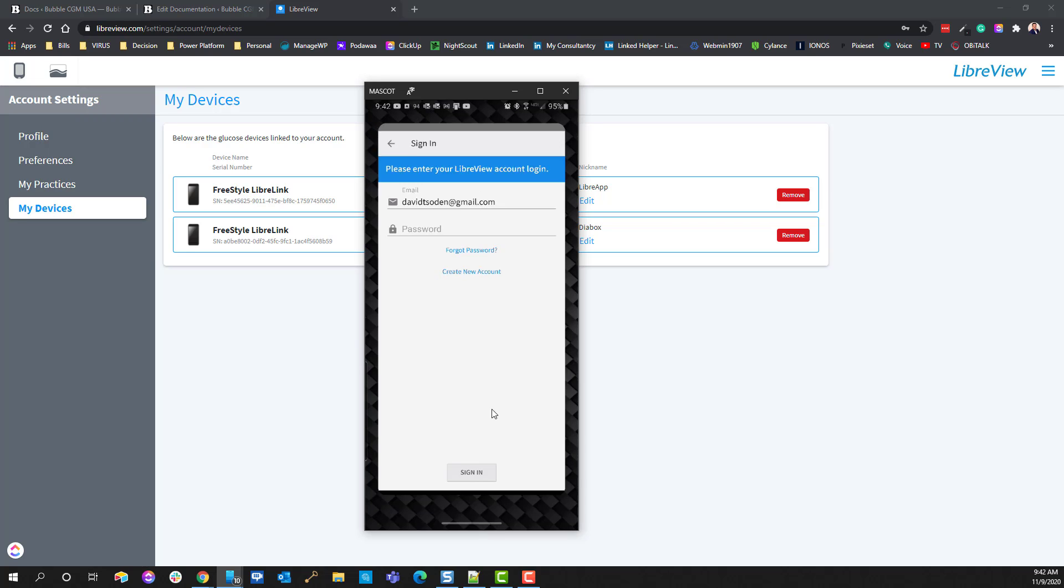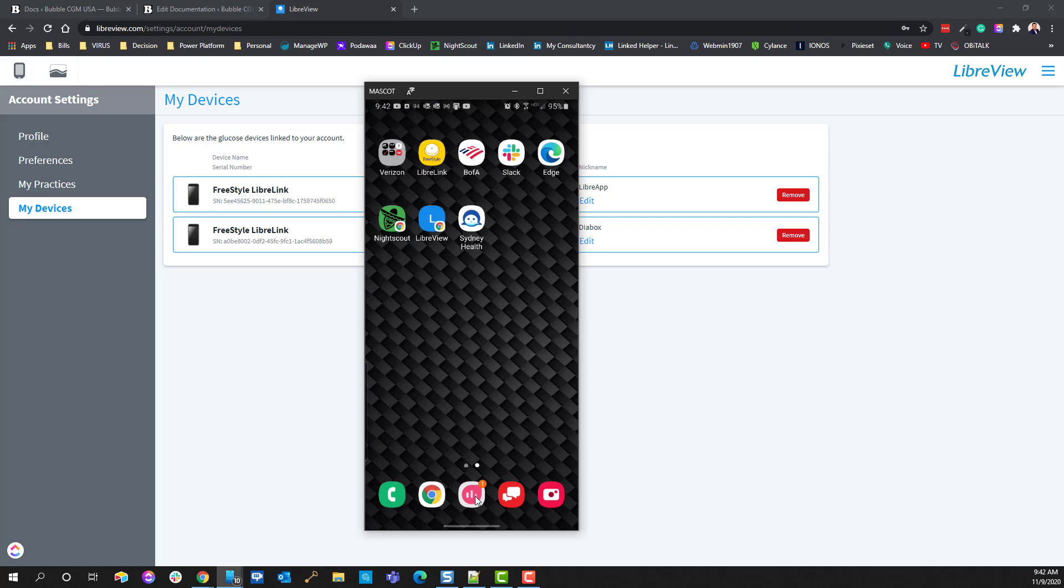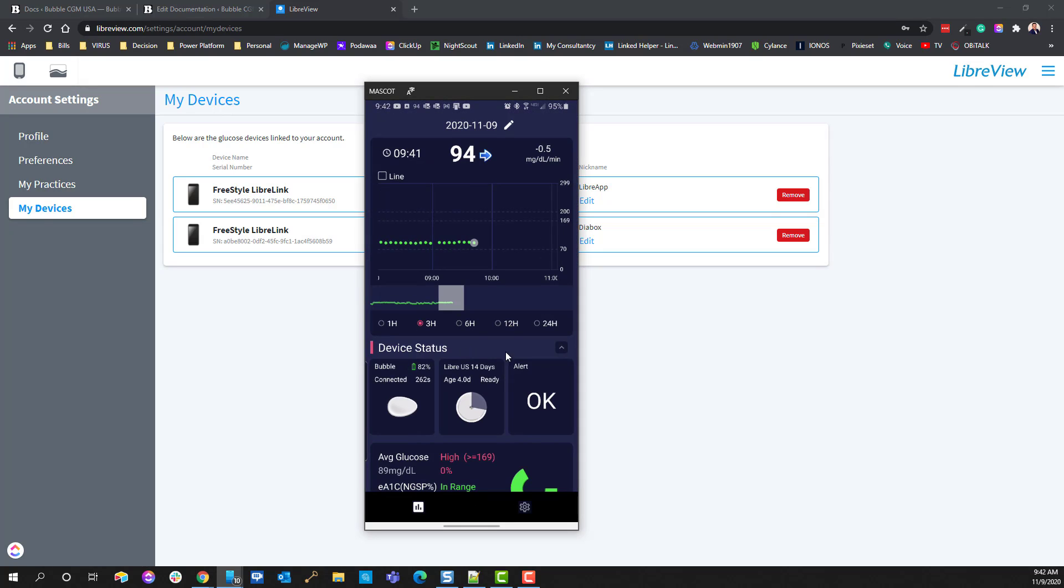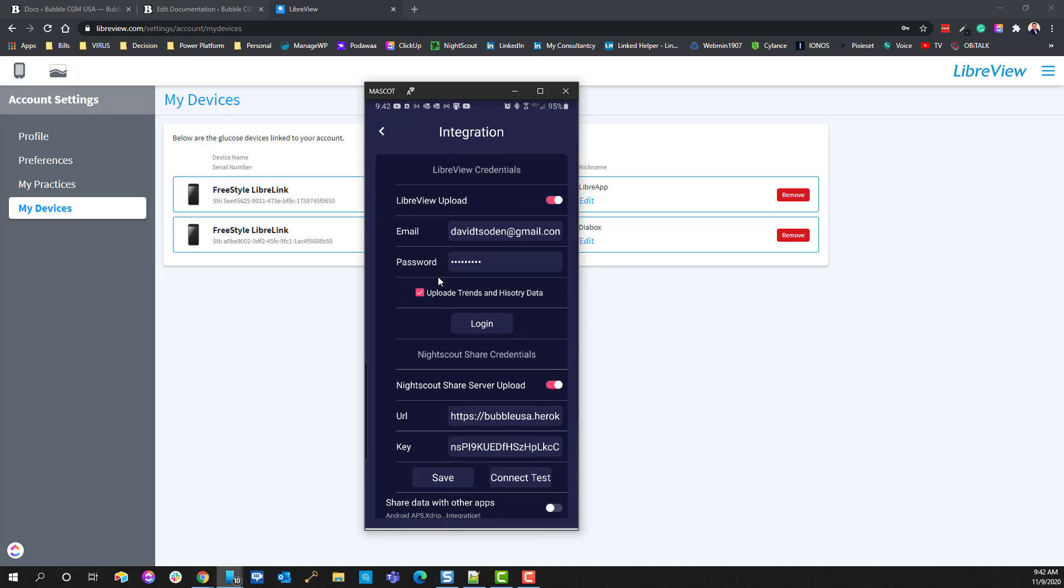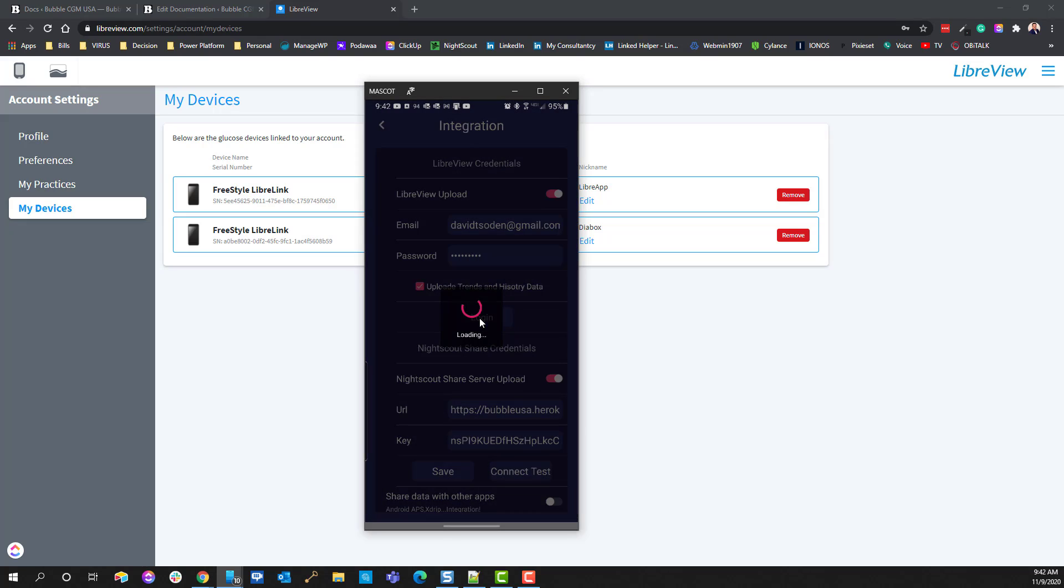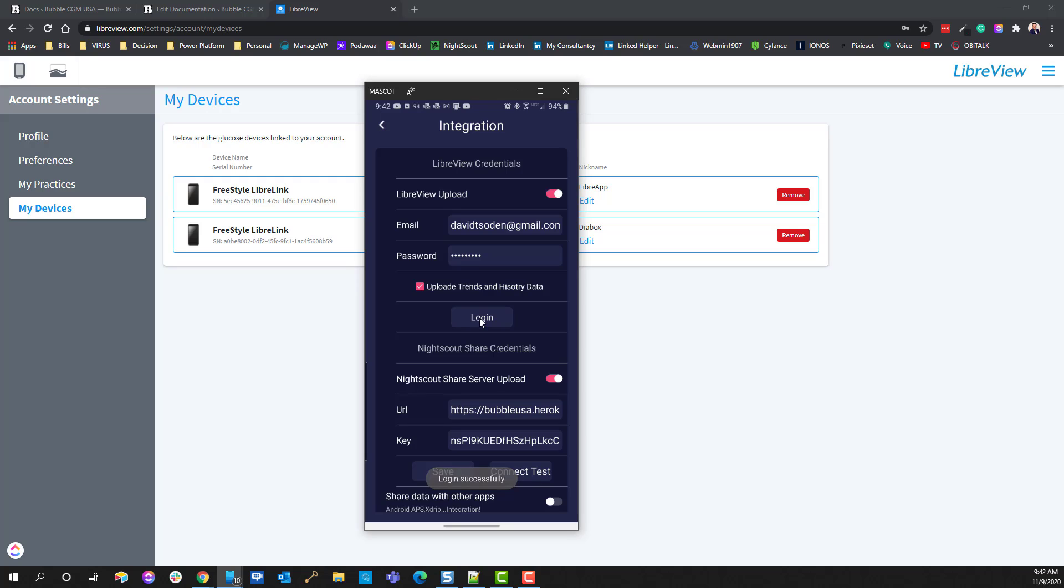Now, the thing is, after you've started the sensor, what you're going to want to do is immediately come over to your Diabox application, go into the settings, and go back into integration, and then go ahead and click on the login button again. And what that'll do is that will log you out of the other Libre app that you use to activate the sensor, and it will reactivate this LibreView integration inside of Diabox.